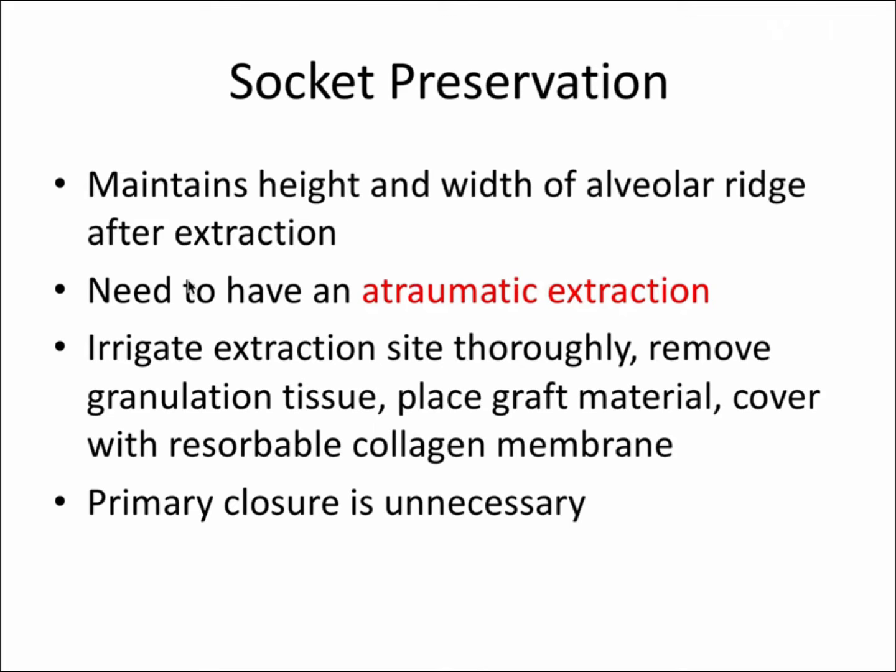So we're shooting for potentially a simple extraction, right? A non-surgical extraction. We're not breaking off the buccal plate of the extracted tooth. We're limiting any sort of trauma to the area. And then we do a lot of the same things we do following an extraction. We irrigate that extraction site very thoroughly. We remove granulation tissue with the curette. But then we also place bone graft material, and we like to cover that with a resorbable collagen membrane. If you remember from the periodontic series, that's some of the things that we talked about with guided tissue regeneration.